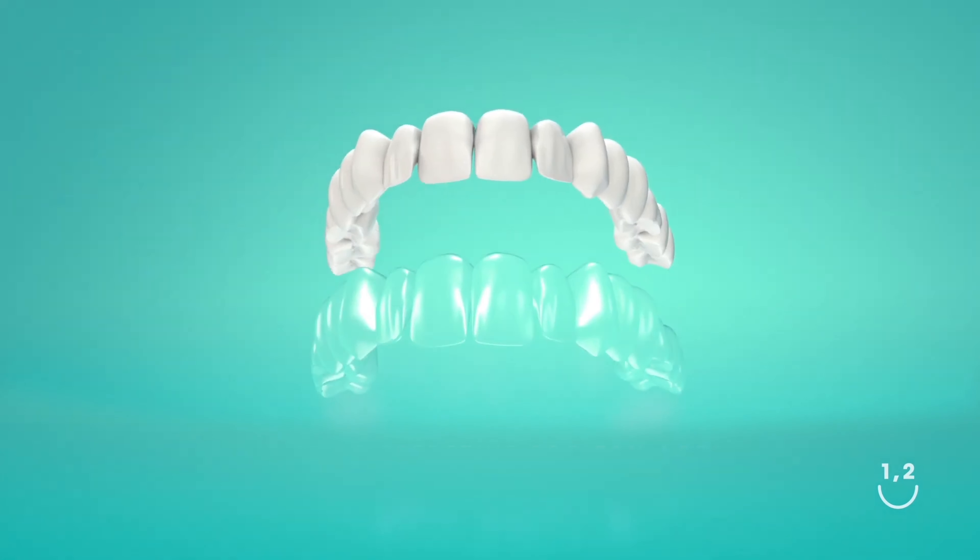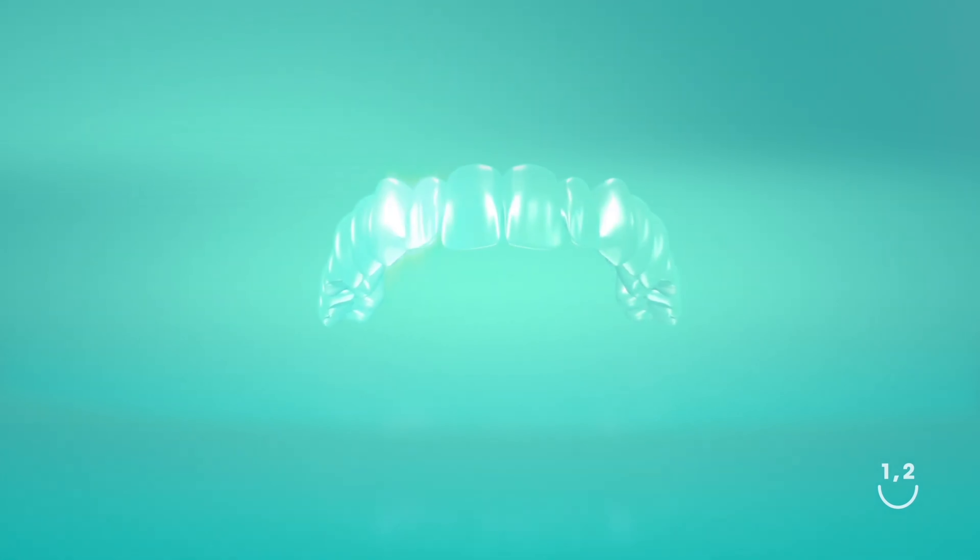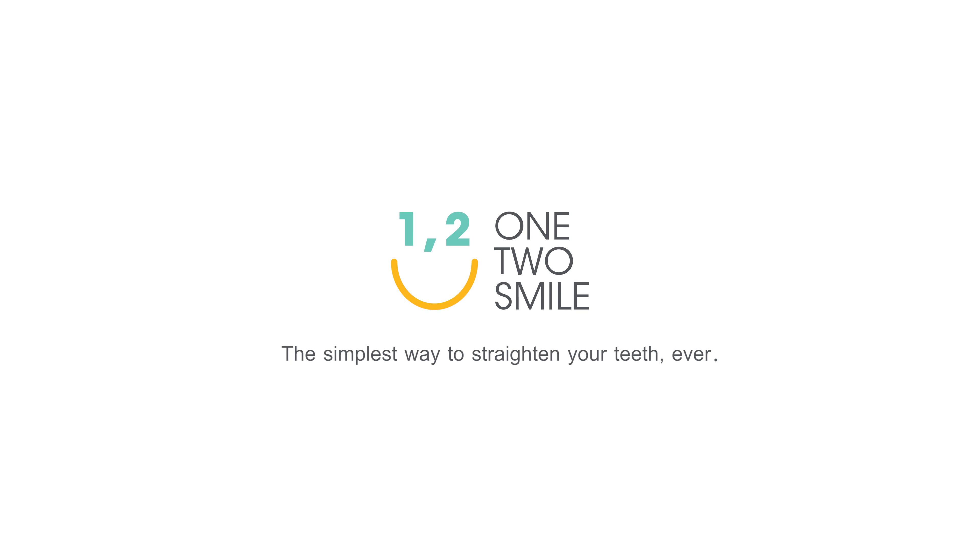One Two Smile clear aligners are the invisible and removable alternative to metal braces. One Two Smile straightens teeth through sets of aligners, each worn for two weeks at a time.